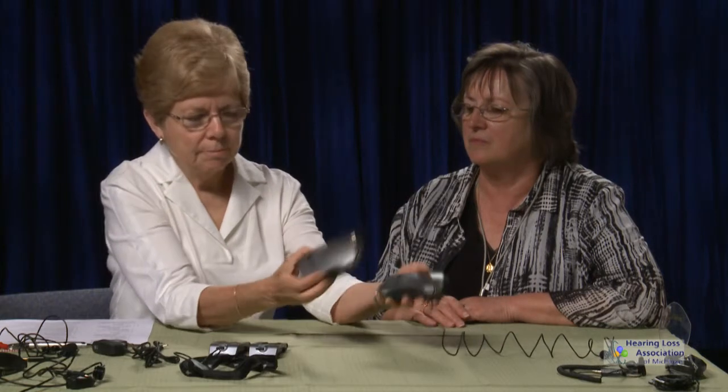This is a comparison demonstration of FM systems, the Motiva and the Comfort Contigo. Okay, Liz, you'd also told me that you'd like to be able to understand better when you go to meetings and to different presentations and those kinds of things. So I have a couple of FM systems I'd like to show to you. The first one is going to be the Motiva, and then we'll go to the Contigo.